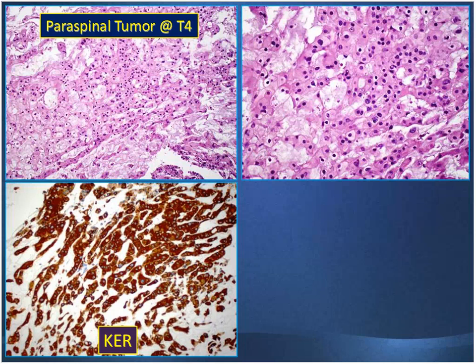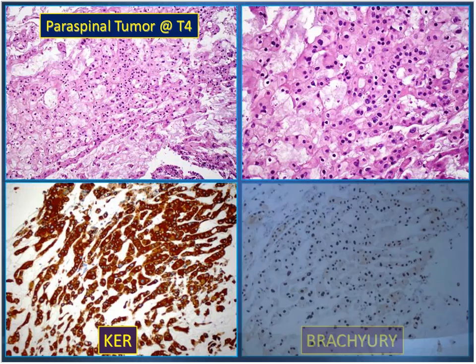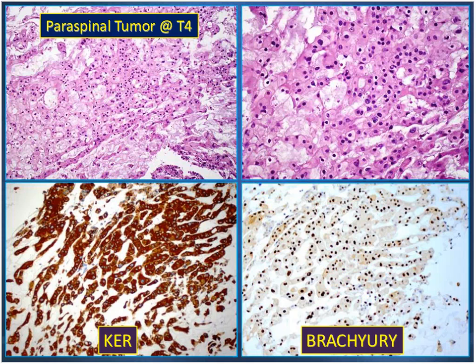However, as you can see, cytokeratin staining was positive, so it was an epithelial tumor. I don't know what prompted us to use brachyury in this case, but I believe it was probably the X-ray finding which suggested that. And here is the nuclear staining for brachyury in this unusual form of chordoma, supporting the clinical and finally the pathological impression.